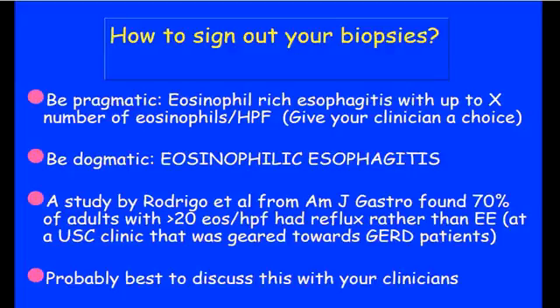So in an individual patient, I'm not sure that you as a pathologist can tell them apart, at least without a lot of clinical information. So we don't even try. We just give them a number, they're happy, we're happy. My residents aren't happy, but that's life.